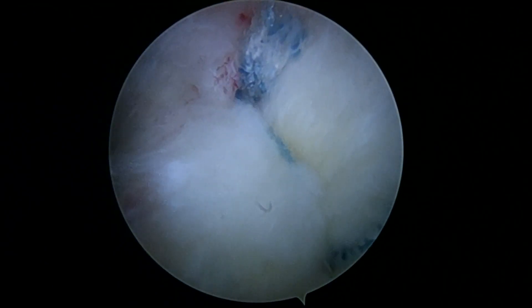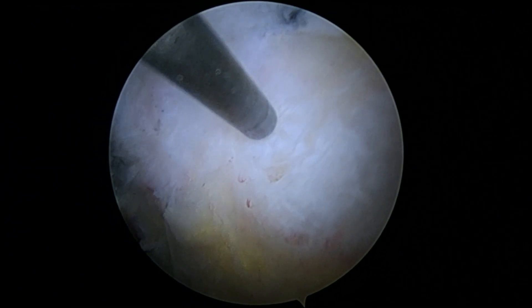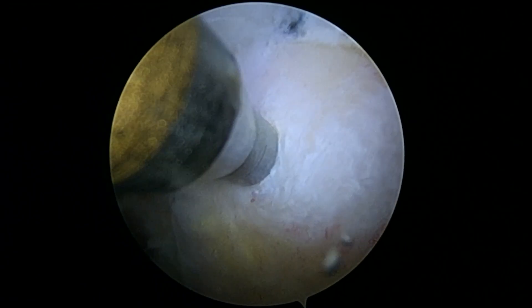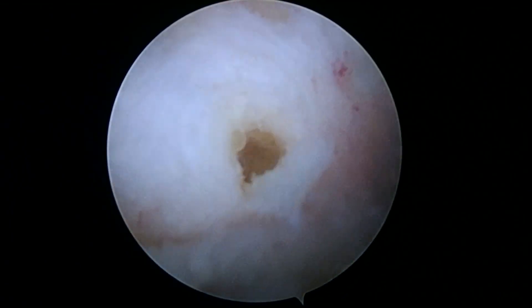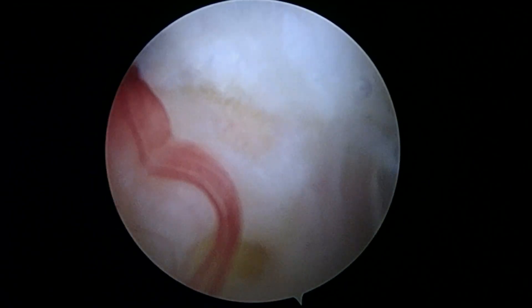This will be the end of the video — we're all done now. We'll take the two millimeter punch and a mallet. There's one little bone marrow vent, and there's another one. As you turn down the pressure, you'll see the bone marrow start to come out of those little tunnels — it's going to look kind of like yellow droplets. There they go. So that looks great. Good luck to you now. Bye-bye.